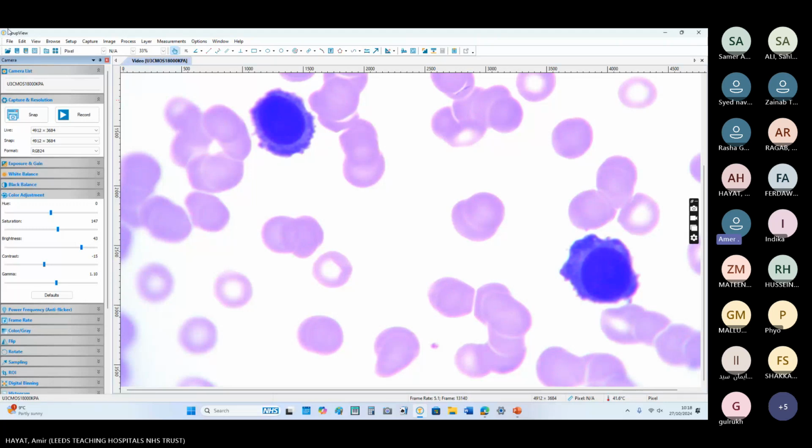If I haven't told you that this patient has multiple myeloma previously, then this is plasma cell leukemia. And if you do flow cytometry, it will be CD56 negative. If I told you that this patient has a previous history of multiple myeloma or CD56 is positive, then it is likely spillover multiple myeloma.